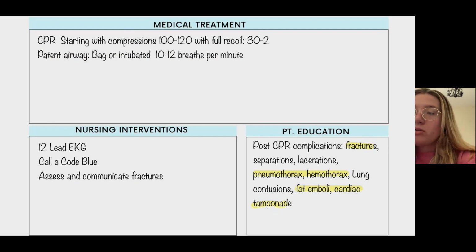So what in the world do we do? Number one, assess your patient first. Just because it says asystole on the monitor does not mean we can go in there and start pounding on their chest. Maybe the leads were off. Go in, assess your patient. Tap, tap, tap. Sternal rub. Check for pulse and breathing. No pulse, no breathing. Let's start CPR and let's start with compressions.